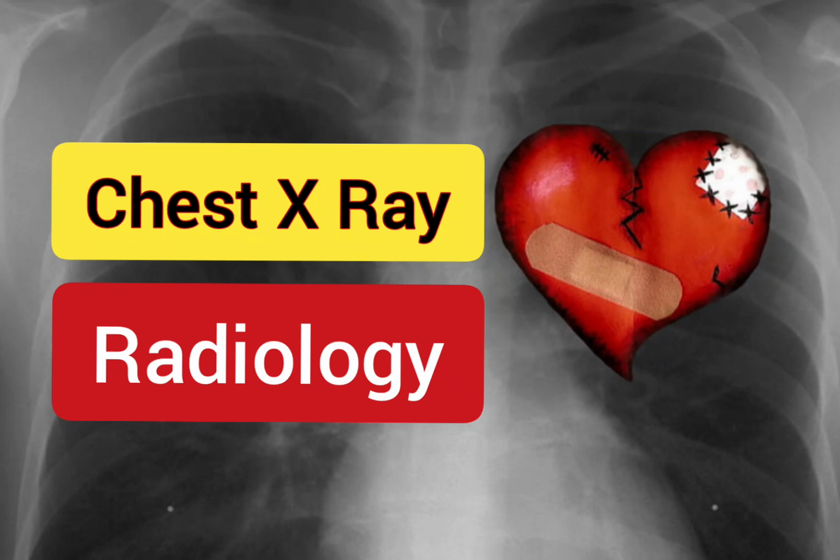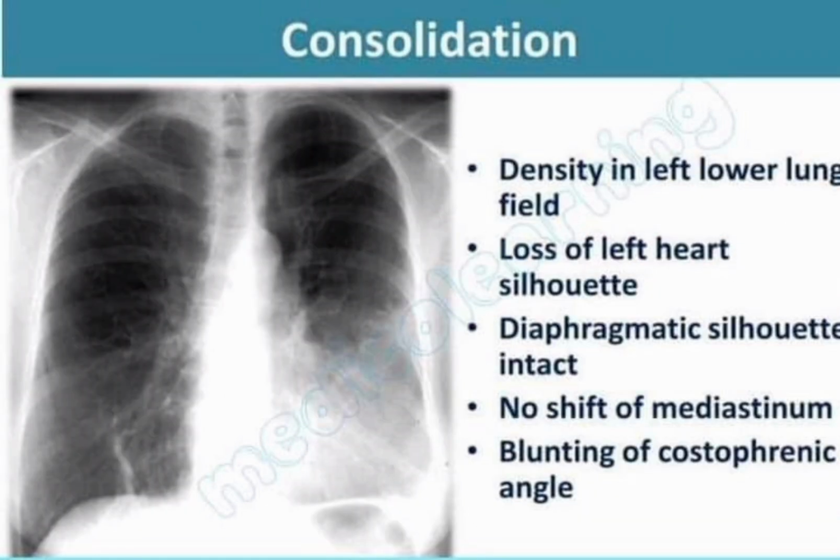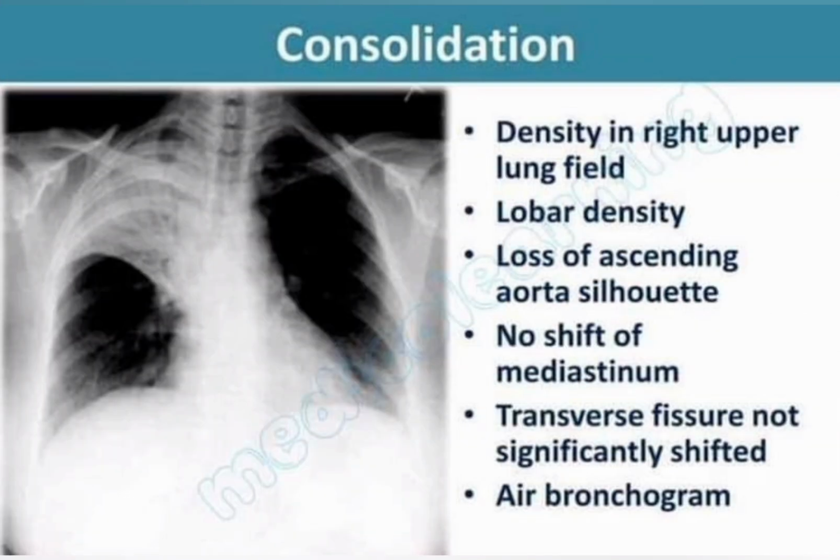A chest X-ray is an imaging test that uses X-rays to look at the structures and organs in your chest. Certain diseases can cause changes in the structure of the heart or lungs. Chest X-rays can show the size, shape, and location of the following: heart, lungs, bronchi, aorta, pulmonary arteries, middle chest area, mediastinum, bones of your chest.